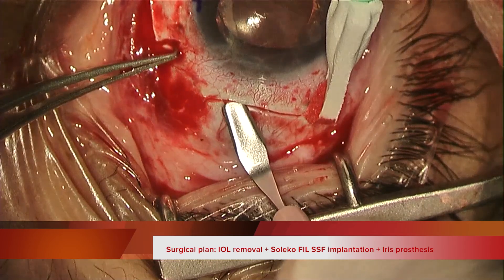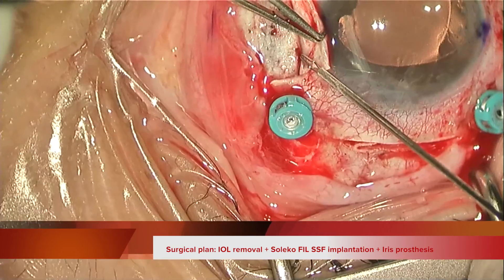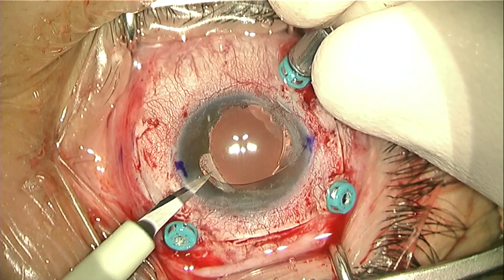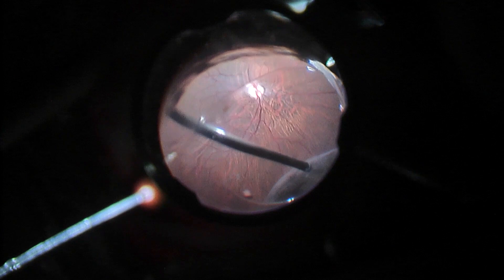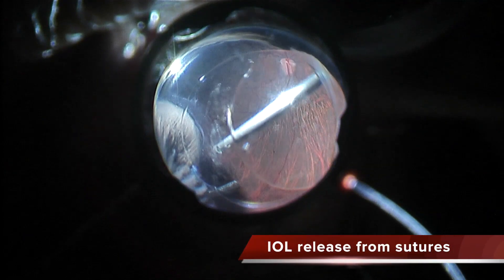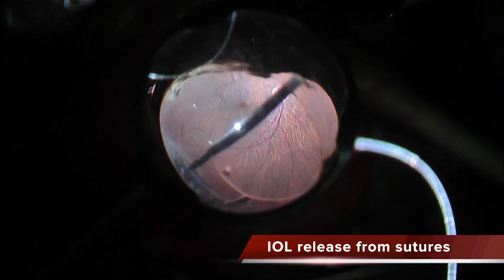I decided to remove this lens because the sutures were exposed, piercing through the conjunctiva. What I did was complete the vitrectomy, which was incomplete, and after cutting the sutures I'm disengaging the lens from the sutures inside the eye, as you can see.